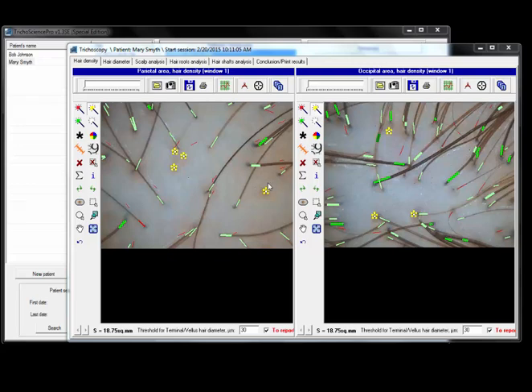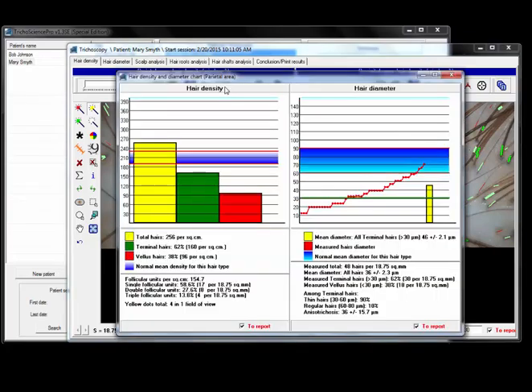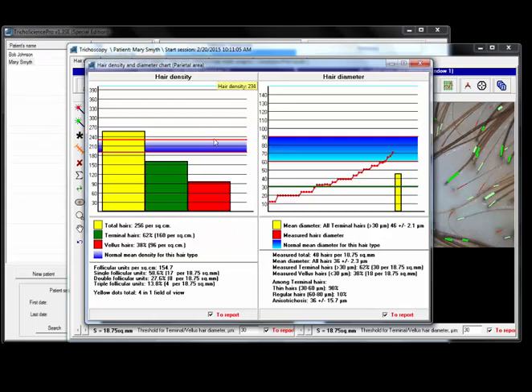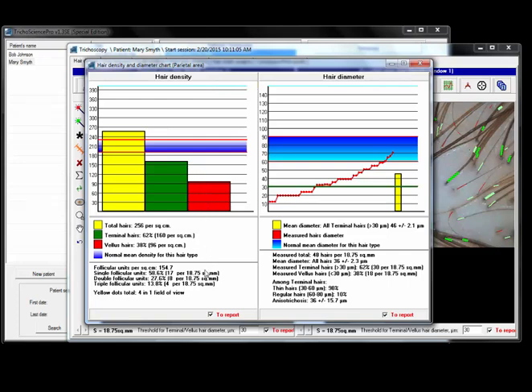So once we've put down all of our markings and made all our measurements, you can click the chart button right here to run the report and measure the hair density. What you're seeing here, this blue line is the normal mean hair density. This is the average. This yellow field indicates the total hairs. The green is the terminal hairs, and the red is the vellus hairs. There's all sorts of calculations here done on the hairs that you can look into as well.